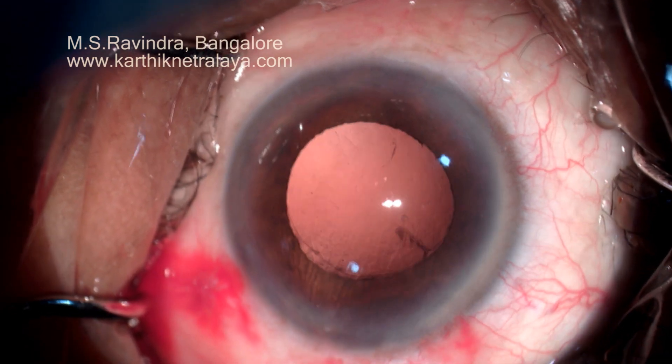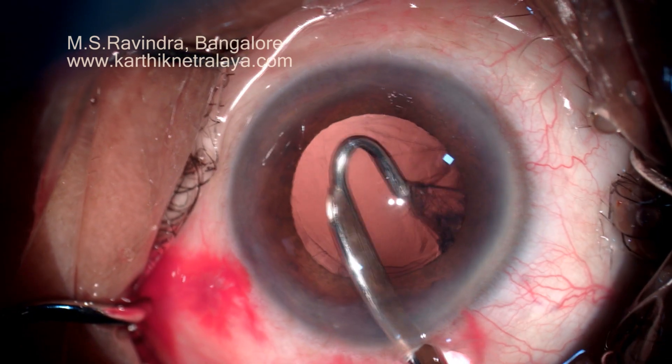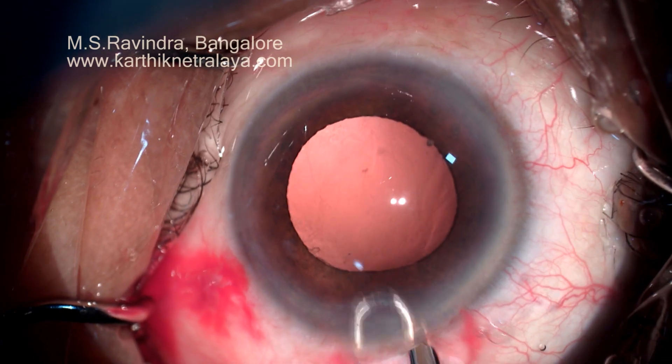The retinal and optic nerve circulation continues to be unhampered during the procedure. See, there is no deepening of the chamber at all. The endothelium is maximally protected by this technique because of continuous visco-infusion while managing the nucleus.